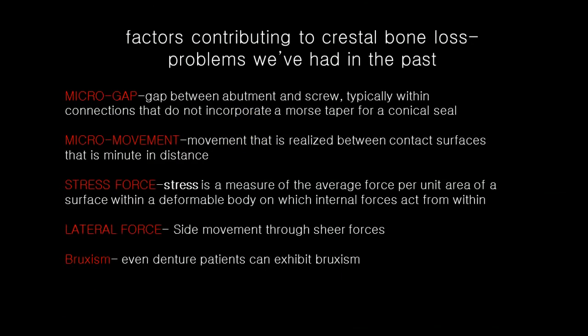Stress is a measure of the average force per unit area of a surface within a deformable body on which internal forces act from within. And lateral force is side movement through shear forces. Bruxism, even denture patients can exhibit bruxism. So we're going to talk about all these different aspects in this presentation. Again, very comprehensive.